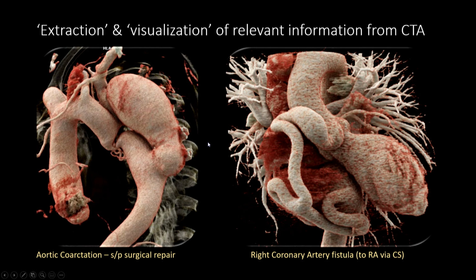So to sum it up, yes, we have tools to do the fusion, whether it is open surgery or endovascular surgery. But still, one of the common challenges is how do you seamlessly work in these CT data sets and extract the content. What I mean by content extraction is image segmentation, which is a technical term, but from a surgical standpoint, the CT data has thousands of structures in it, but how do you make sure you extract and quickly get that information?